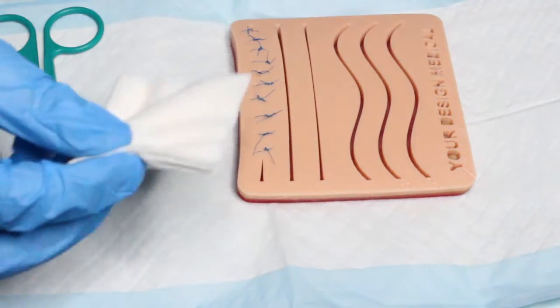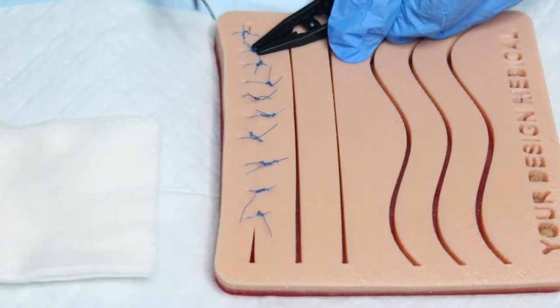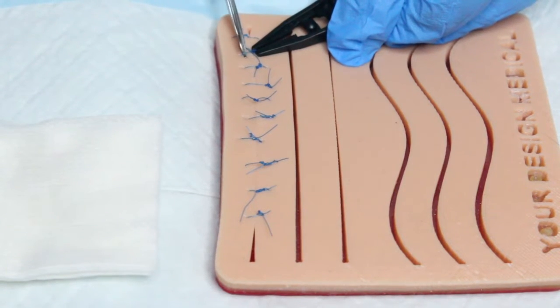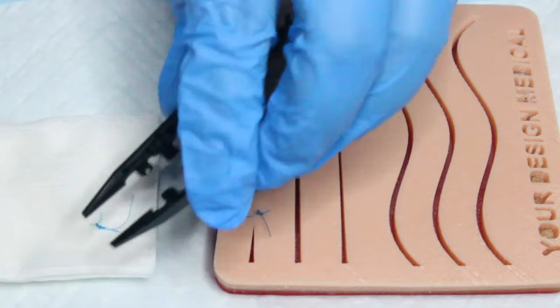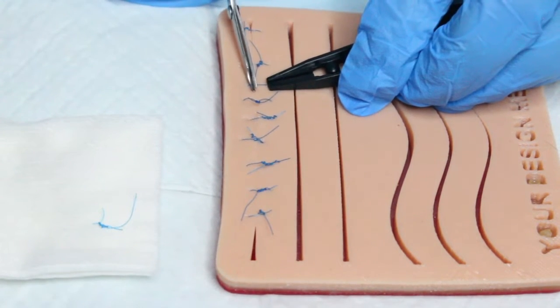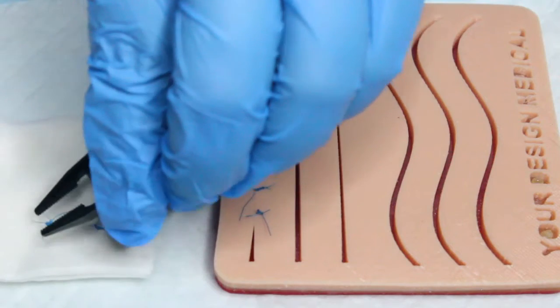Place a gauze square close to the incision site to place the removed sutures on. Use tweezers or forceps in your non-dominant hand to gently pull up the knot, and slip the tip of the scissors underneath the suture close to the skin using your dominant hand. Cut the suture as close as you can to the skin at the opposite end of the knot. While holding the knot, gently pull the suture through the tissue and place it on the gauze square. Continue taking out sutures, skipping one in between, and applying steri-strips if ordered by the provider, until all sutures are removed.